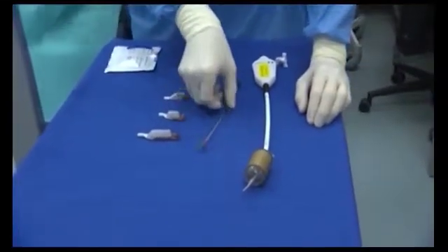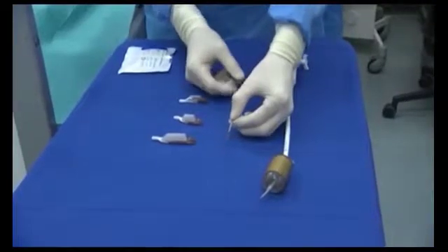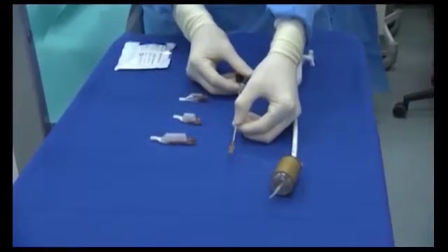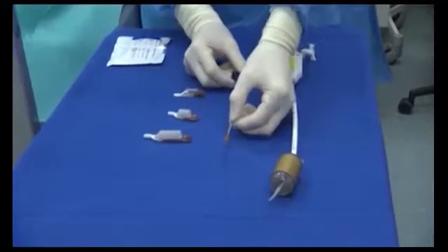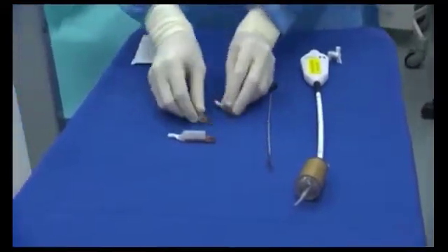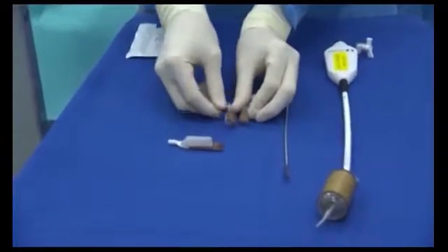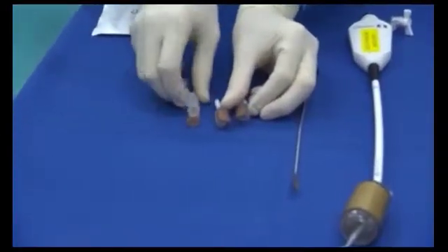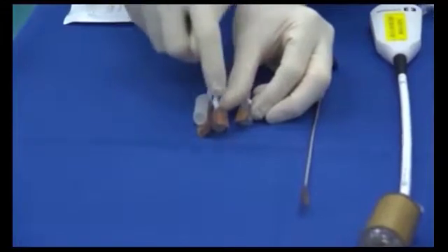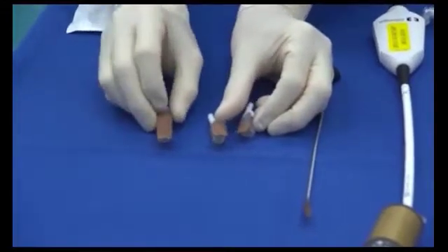Here we have the so-called channel catheter, which can be introduced via the working channel — that would be one option for today. It lets you treat small lesions in a very targeted way. And then these are the focal devices with which you can press up onto the wall and give a targeted treatment. There is the 60, 90, and the ultra for very large areas.